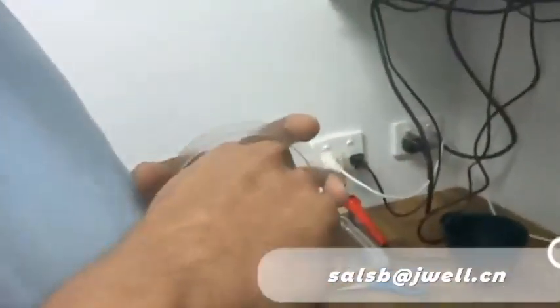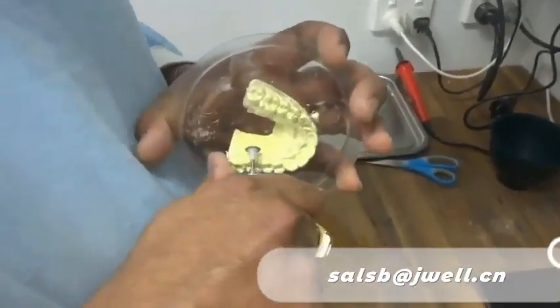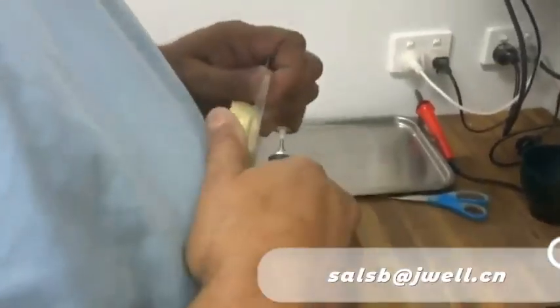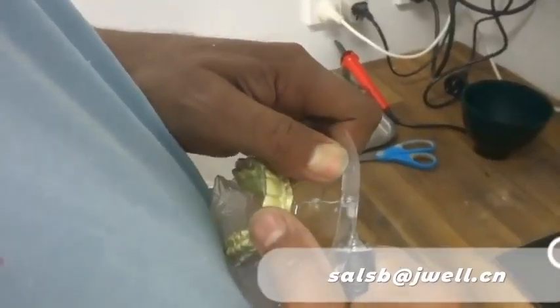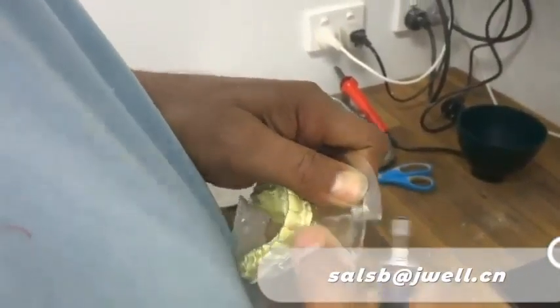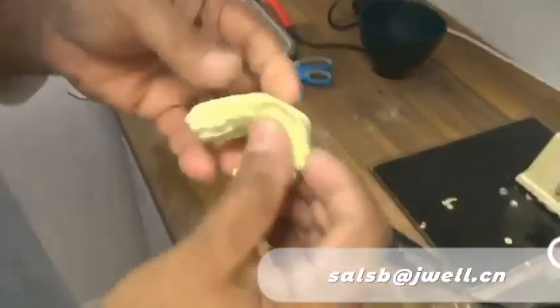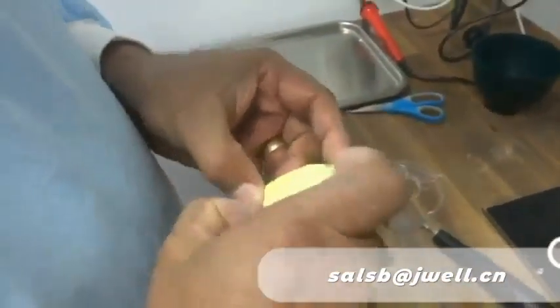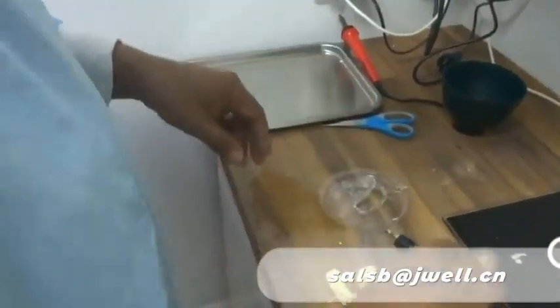So I've trimmed that almost all the way around now. Make sure it's all cut nicely. Next thing I do is I take the blank off. Sometimes they're a little bit difficult. When they're a bit difficult, this is what I do. I just cut the excess material away. See, it comes away quite nicely. And then you just peel it off, like so. The teeth usually break. Okay, so that's pretty good.